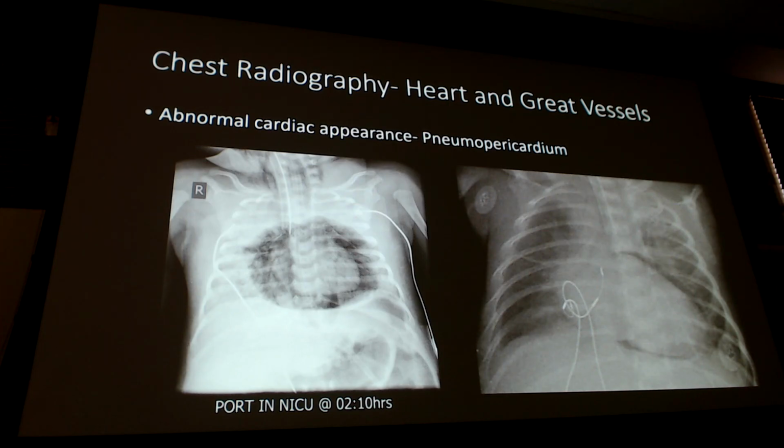Boy, if only we could all have all pediatric x-rays, right? So this is one of your iatrogenic ones. So this is just to show you, particularly in neonates and kids, how this can happen due to complications of the vent. We can cause a pneumopericardium. Okay, so these are the kind of things you'll see when you're on a strict call. Hopefully not. But just to give you an idea what it looks like in peds.